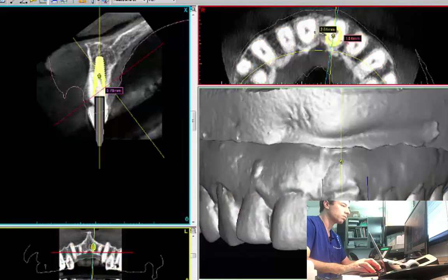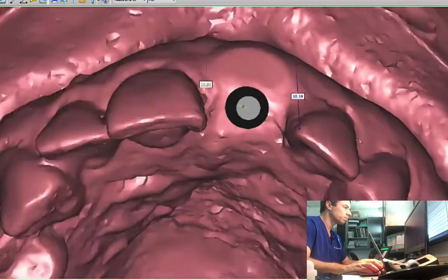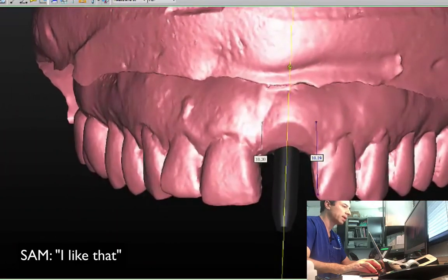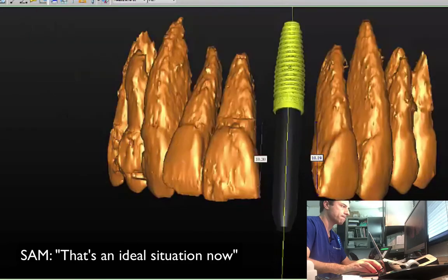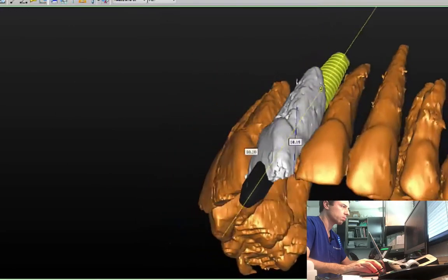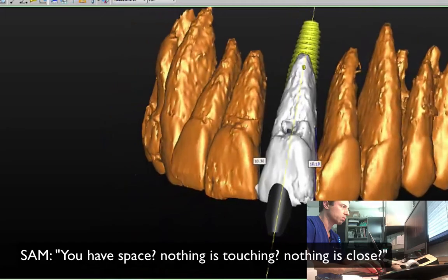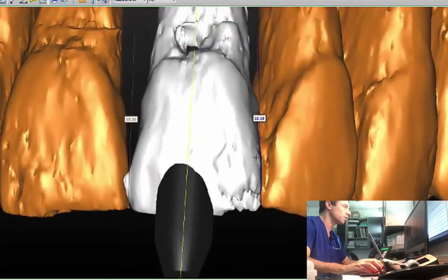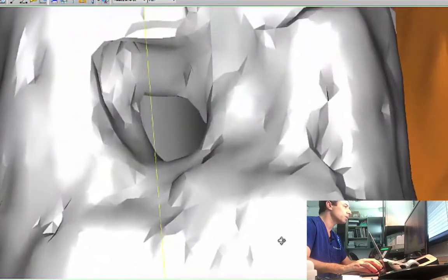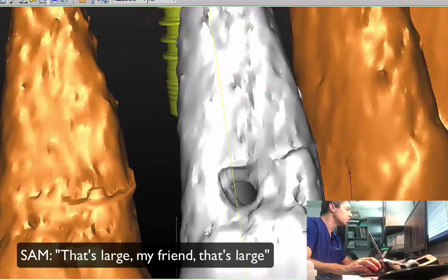What do you think? Let me look at this. Can you make the image bigger? Probably not. No, I like it. You like that? Yeah. That's an ideal situation now. Look — you have no roots, you have space, nothing is touching, nothing is close enough. You see this hole in the tooth? It's pretty impressive — you can look through it. You can see the future.